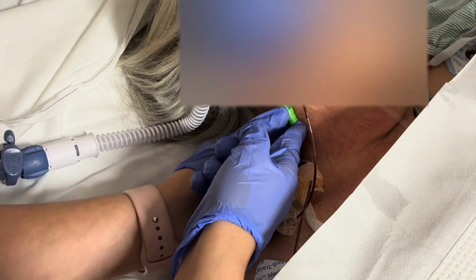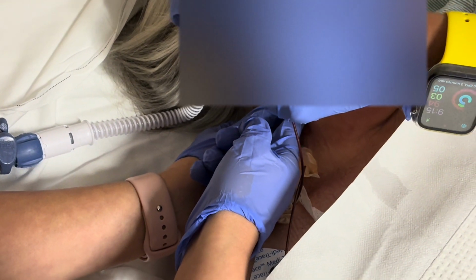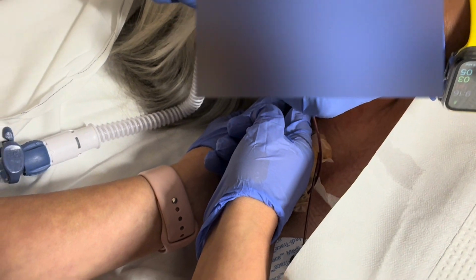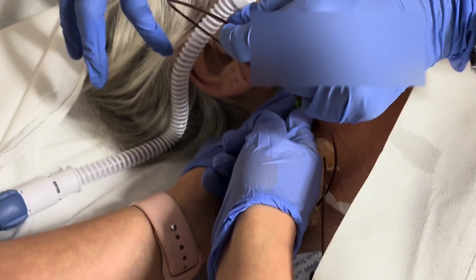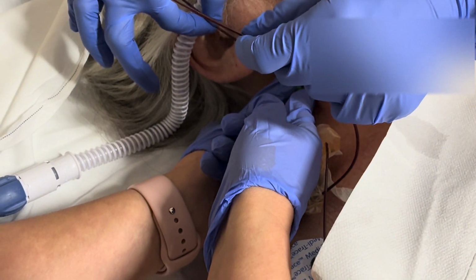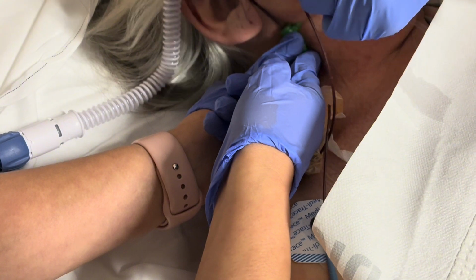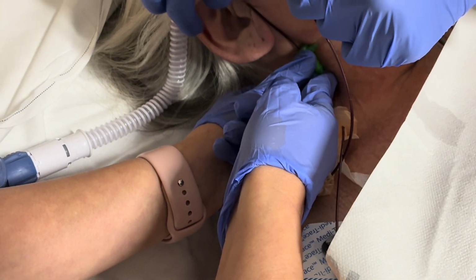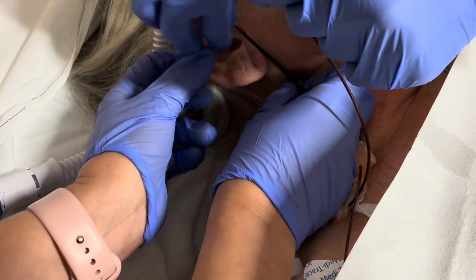And the thrombolytics that they give, it's a very low dose, so it has a decreased risk for bleeding because it's a very low dose. They usually would leave this in for like 14, some doctors leave it 16, 18 hours. And then after that, we take out the EKOS catheter. So as long as there's no resistance, we slowly take it out.